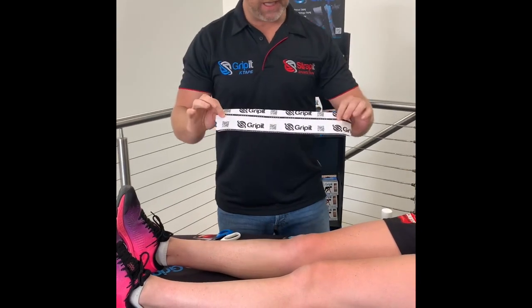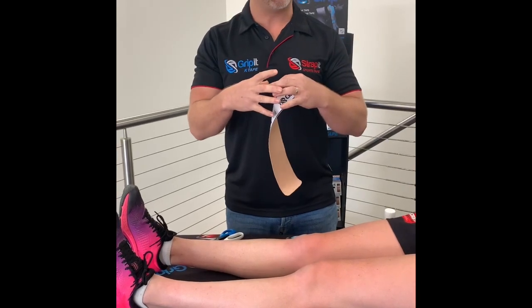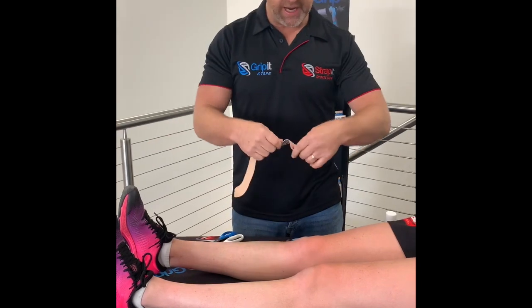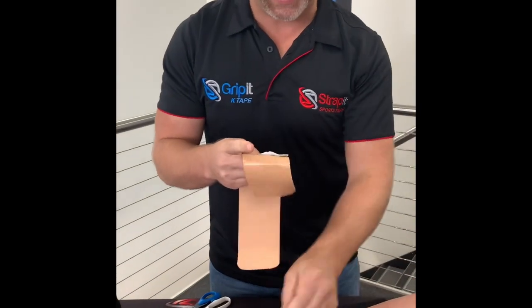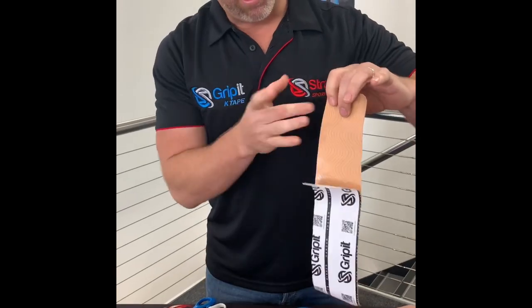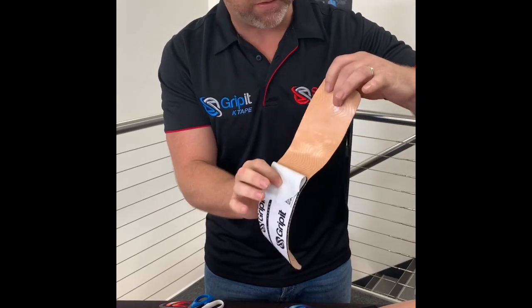Here's the 2 layer. I like 2 layers or 3 layers on the lower limb because the energy storage requirement is greater, because it's the end of the kinetic chain of the body. If you watch carefully, if we come in close and have a look at the tape, we need to prepare some very good size anchors. An anchor obviously is the end of the tape. I try not to touch the tape too much, so I've just got a little bit of tension on the glue, a little bit of touch, and that shouldn't affect the tape.